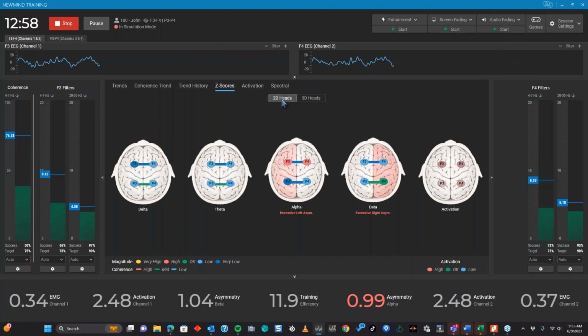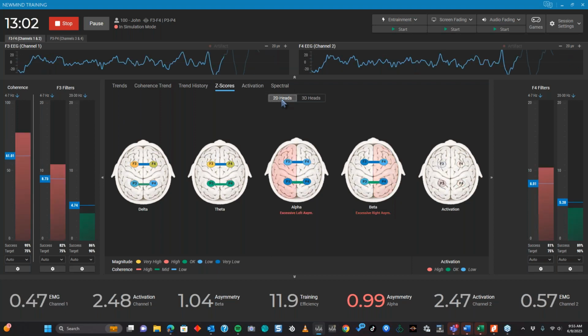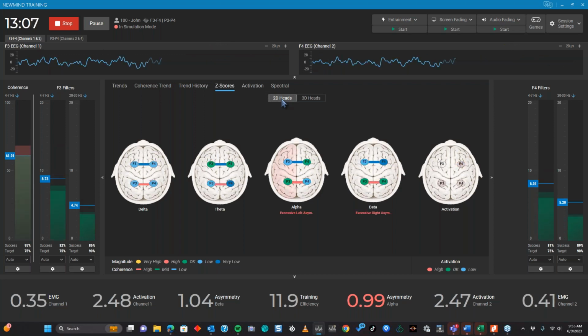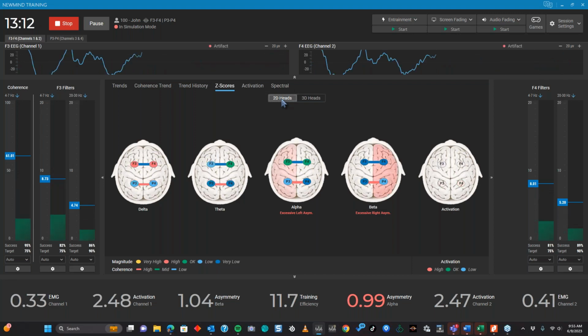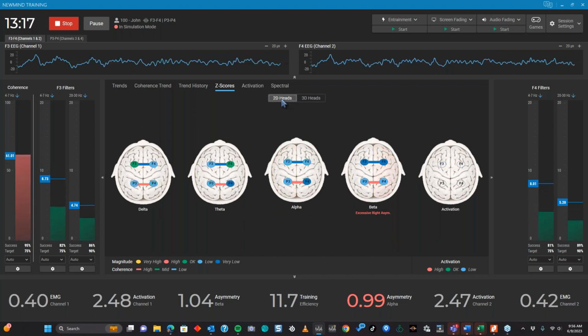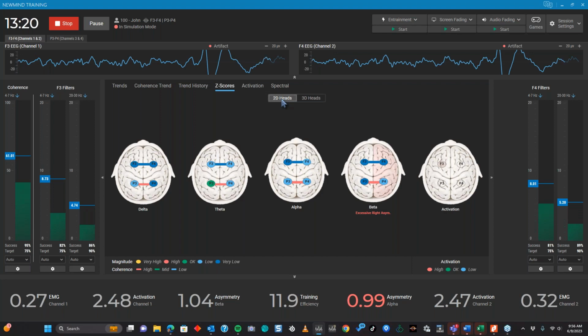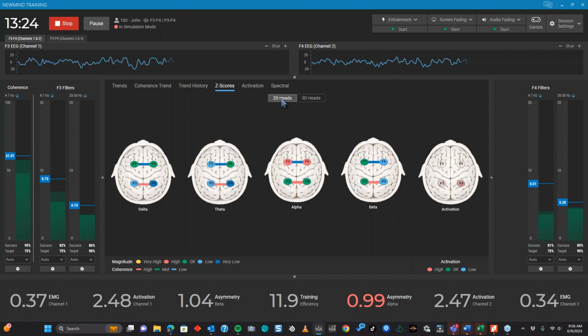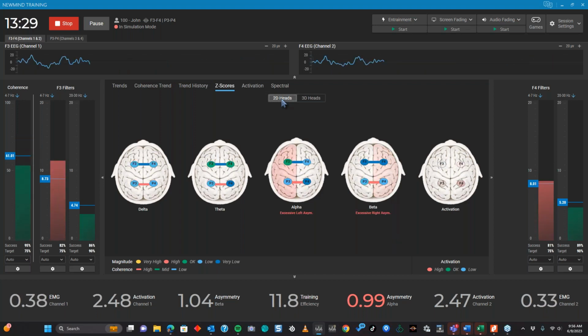Not only could it cause artifact, but it leaves them in a state of kind of disgust the whole time, thinking, God, I really don't want to listen to this, or I really don't want to watch this. You're not going to get as good of training. It's kind of like what I had mentioned with the movie that Dr. Suter's client wanted to watch. There was probably some change in her brain activity, but it wasn't until they found some appropriate content that they actually saw big changes happening.